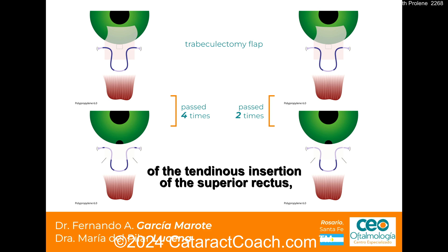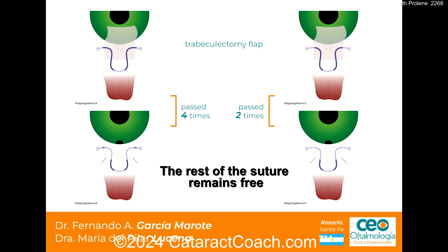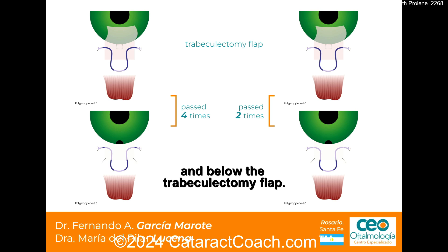Perpendicular to the scleral flap, and a superior one at the level of the tendon insertion of the superior rectus. In the form of a loop, kind of an omega shape, with an introscleral path of about 2mm. The rest of the suture remains free in the subconjunctival space and below the trabeculectomy flap — that's what prevents the fibrosis.